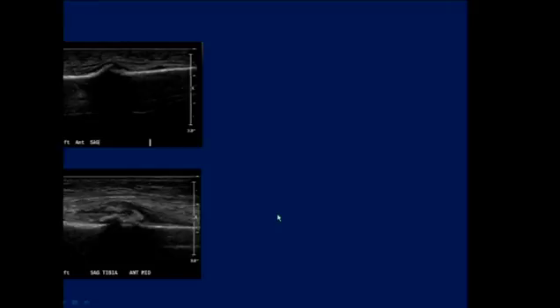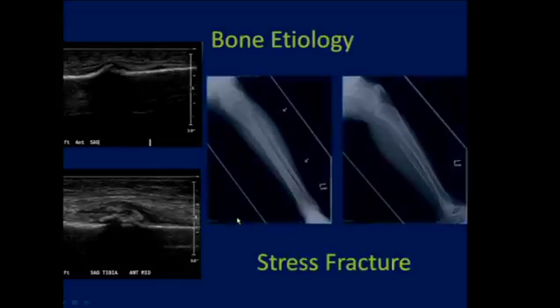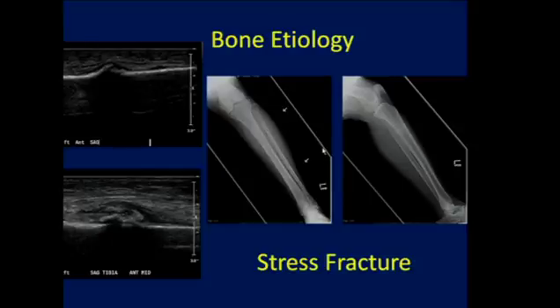Sometimes people come to us and the cause of the bump is actually bony in etiology. I've seen people with exostoses or spurs that have caused lumps and bumps. But in this patient, this woman pointed right to this area where there is cortical discontinuity, and along the side I can see some callus formation, and sure enough, this is someone who had a stress fracture. This is a woman who walked over 2 hours every day.